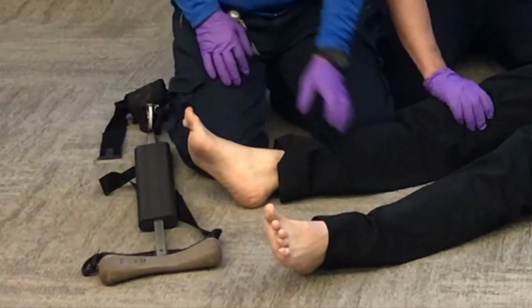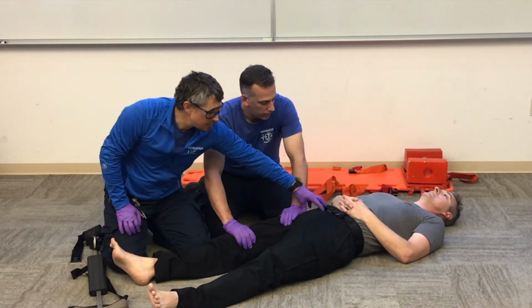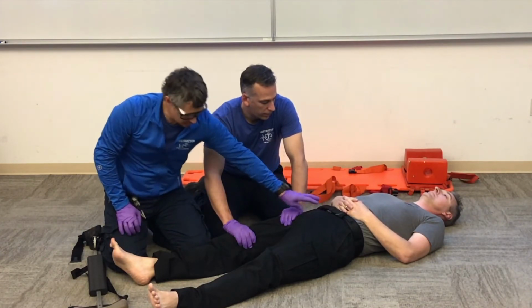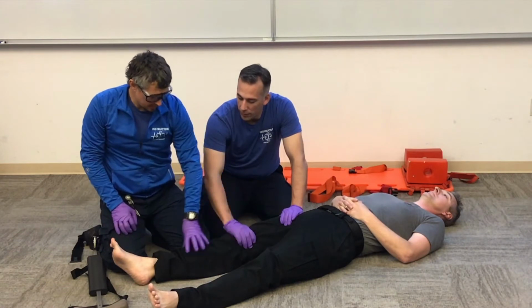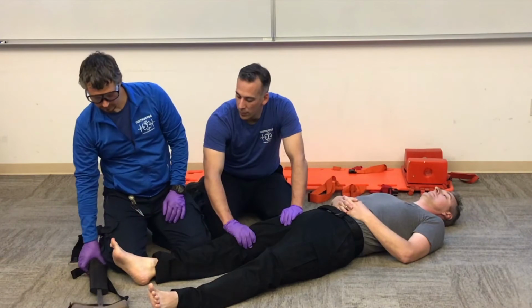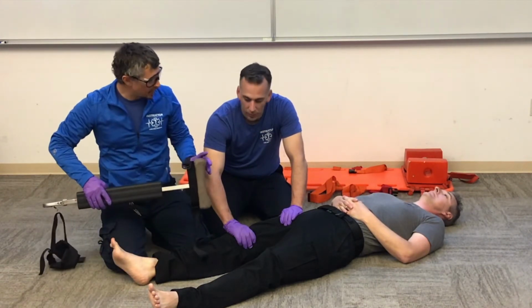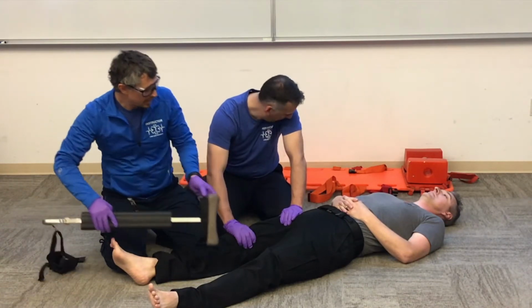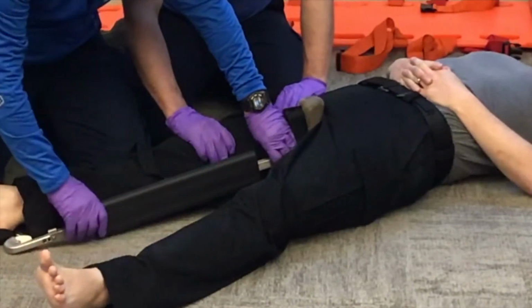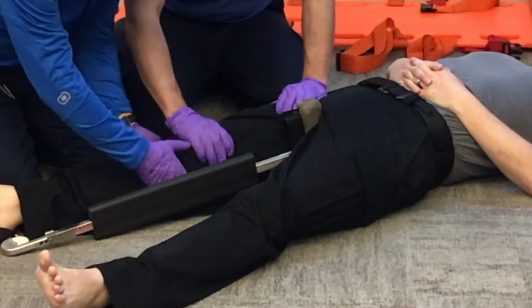Little toe. When we put on a traction device, we want to make sure that we have no pelvis involvement, because pelvis injury is going to be a contraindication. No knee involvement, tibia involvement, or ankle involvement. All right, Chandler, this device is going to go high and tight in your groin. If you have anything you need to move, adjust yourself now. Okay? Talking to our patient to move their parts out of the way is important.